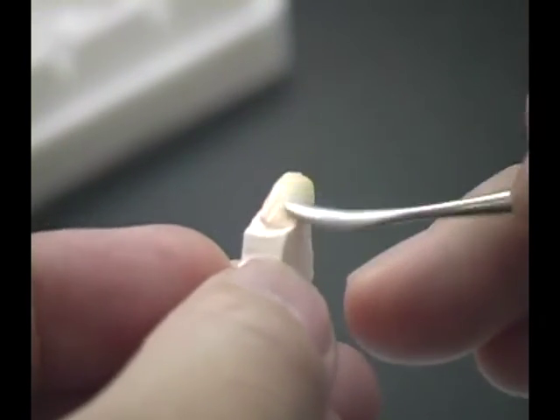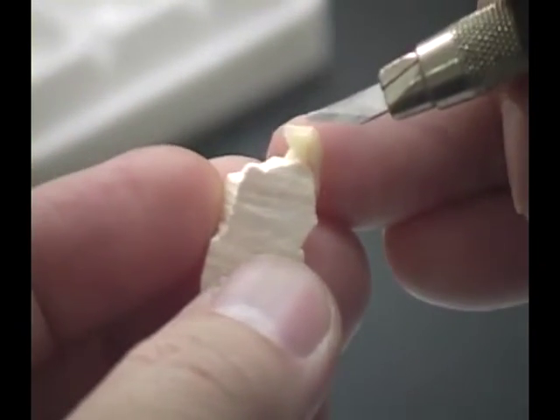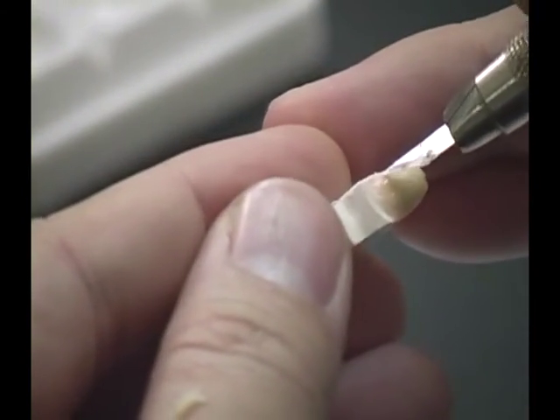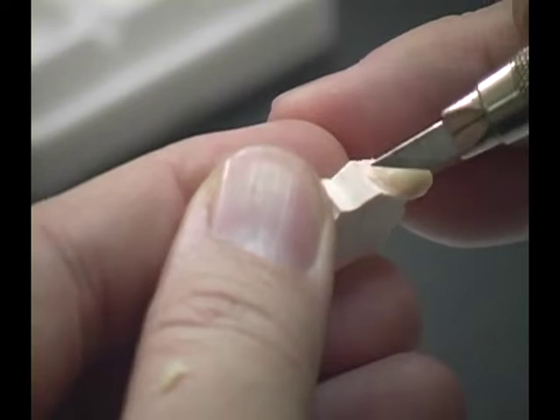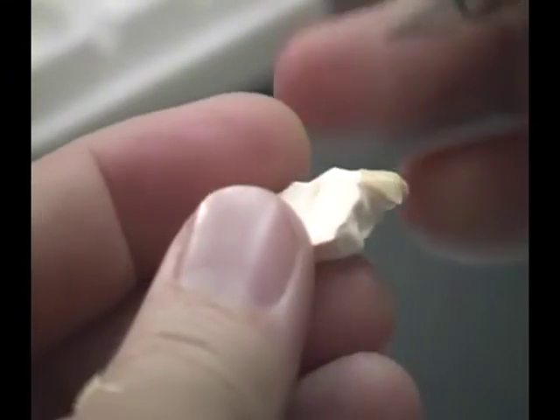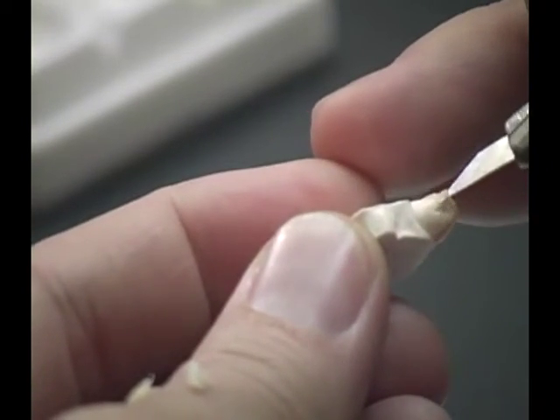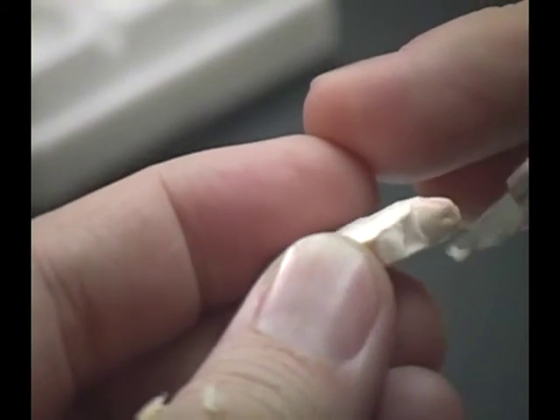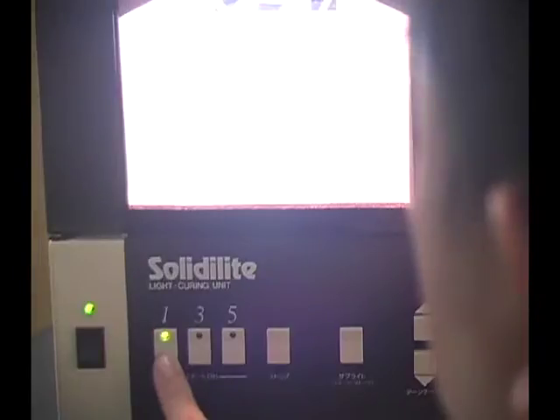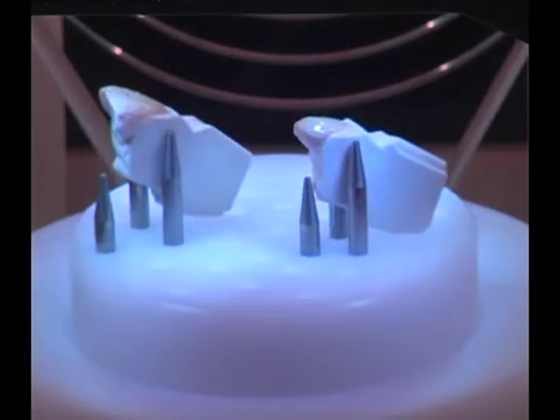Apply the Ceramatch body on the lateral incisor in a similar manner. Remove the excess material with the cutting knife. Place the two dies in the light box and cure for one minute. The rotating platform ensures uniform and complete cure.